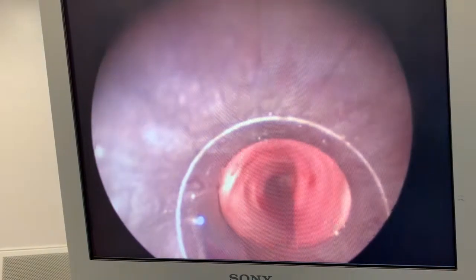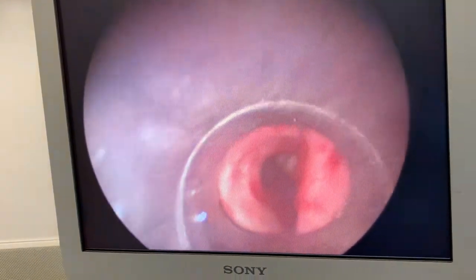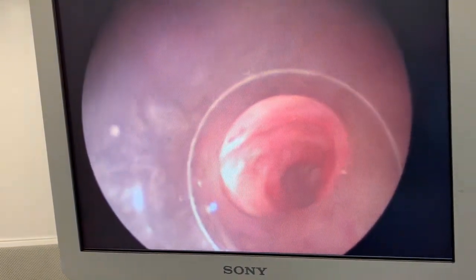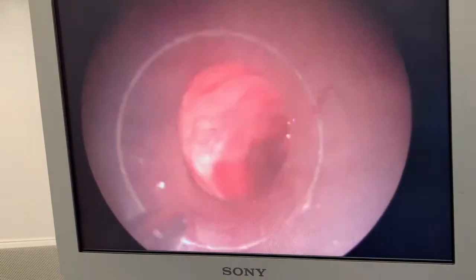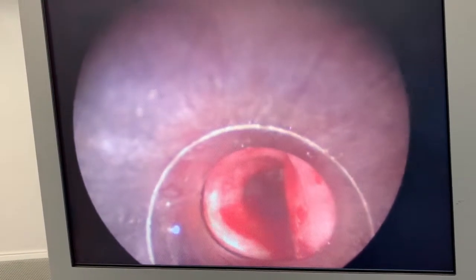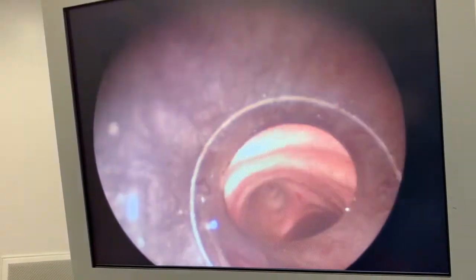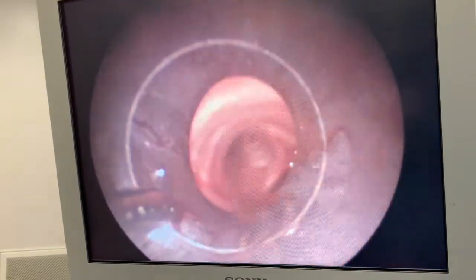There you can see in the right main bronchus there's some blood and an abnormality with external compression on the distal trachea and proximal right main bronchus from the tumour.